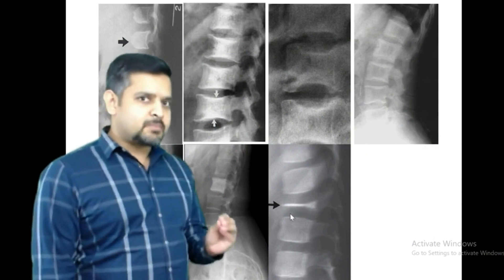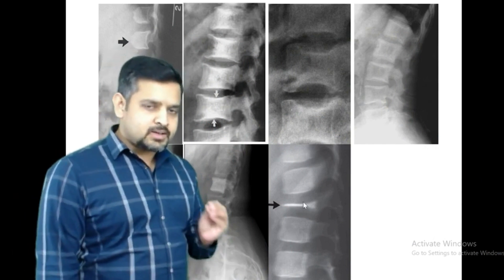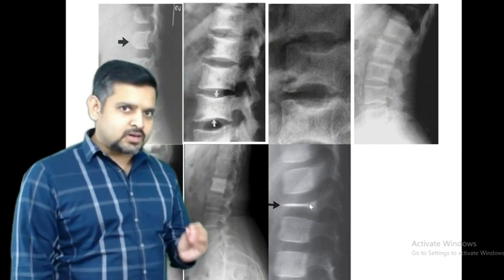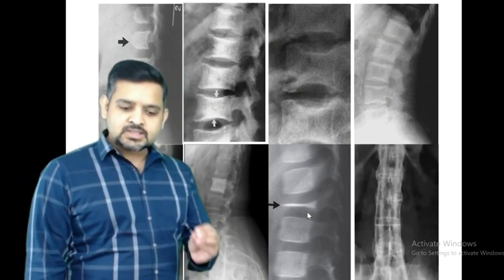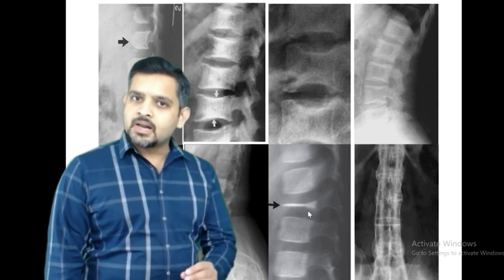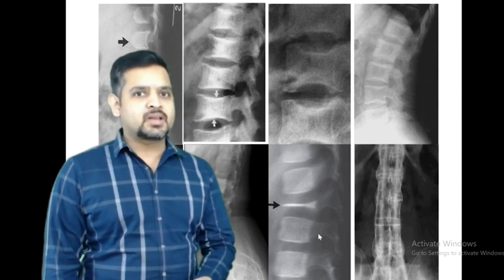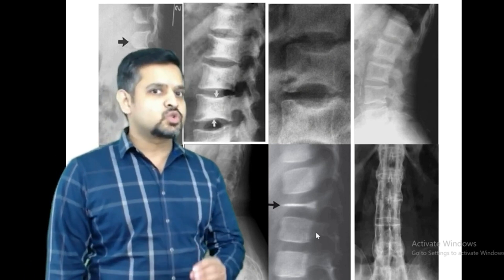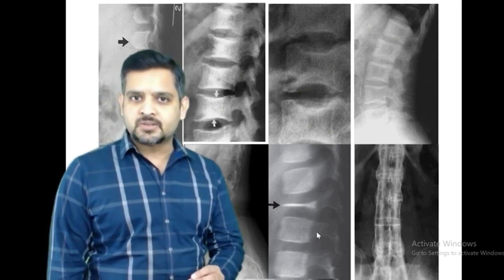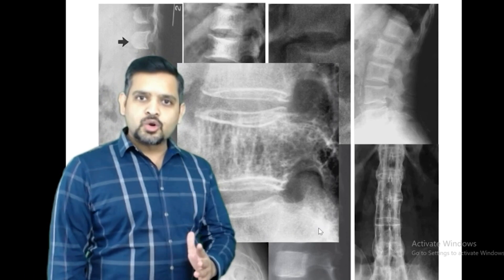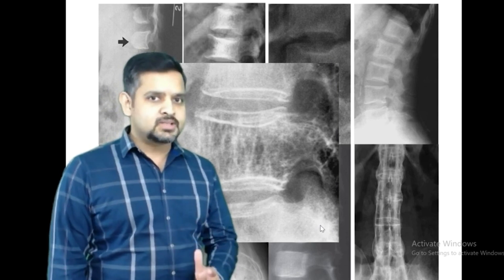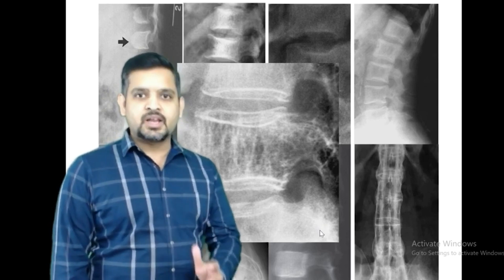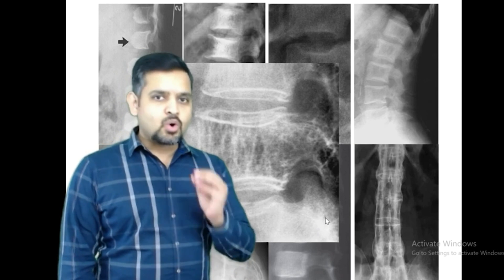This is vertebra plana in eosinophilic granuloma, and this is a typical bamboo spine seen in ankylosing spondylitis. This is a corduroy appearance seen in vertebral hemangioma.